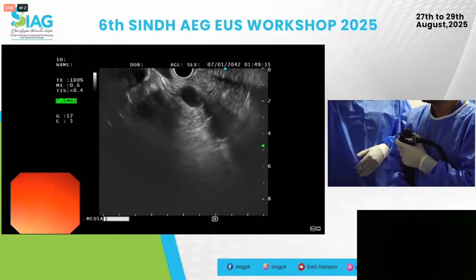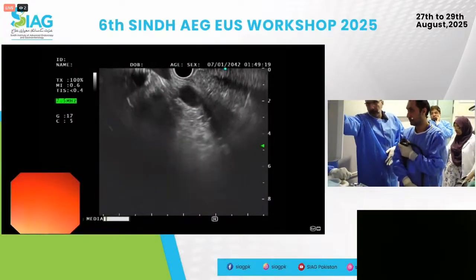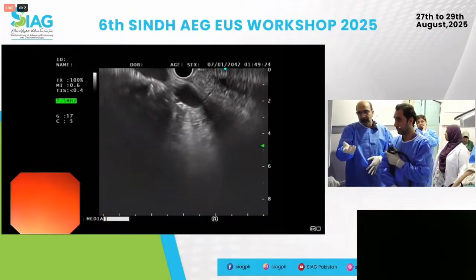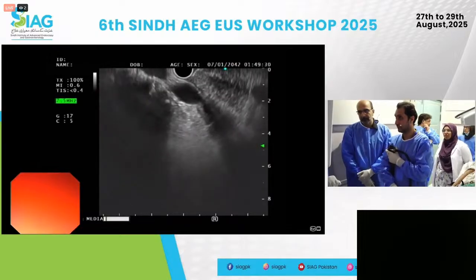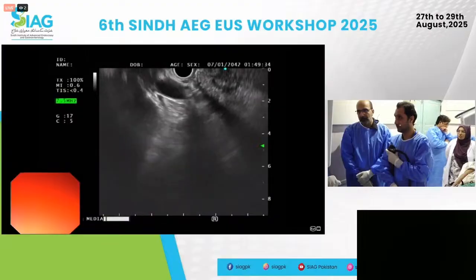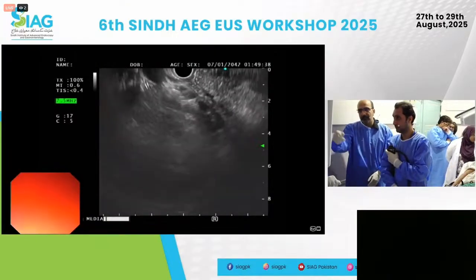So if that is PD, why don't we bring the pancreas more to 6 o'clock? So relax a tiny bit. It's a big wheel. Relax. Okay, so that's your uncinate.